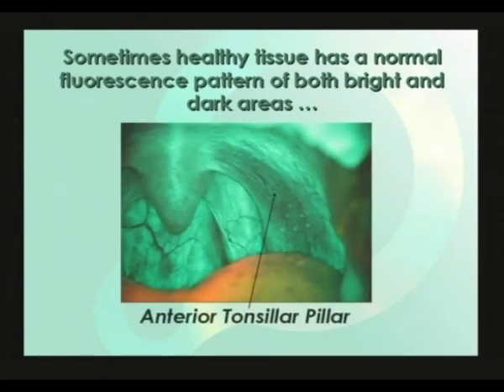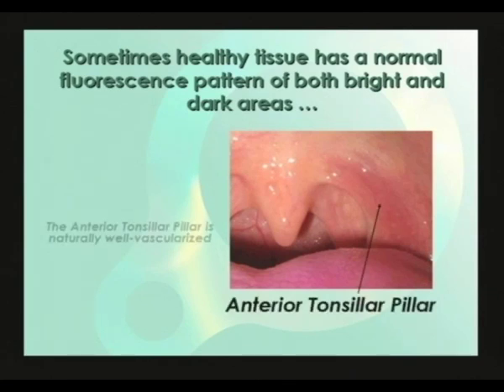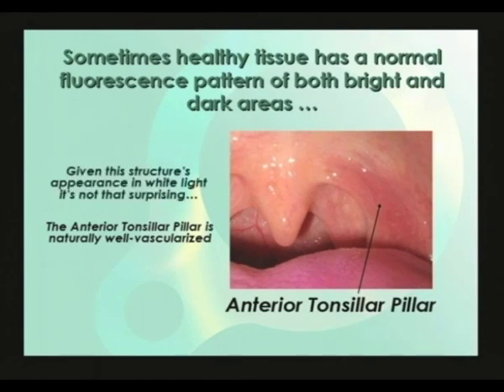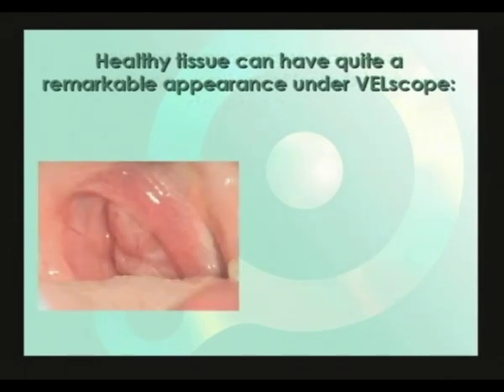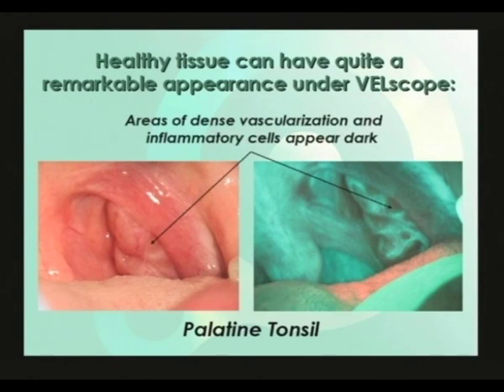The anterior tonsillar pillar typically shows up as dark under Velscope. As we can see from its appearance under white light, the anterior tonsillar pillar is naturally well vascularized, so it shouldn't be too surprising that it appears dark under Velscope. Some structures in the mouth have quite a remarkable appearance under Velscope. A good example is the palatine tonsil, where the areas of dense vascularization and inflammatory cells appear quite dark.